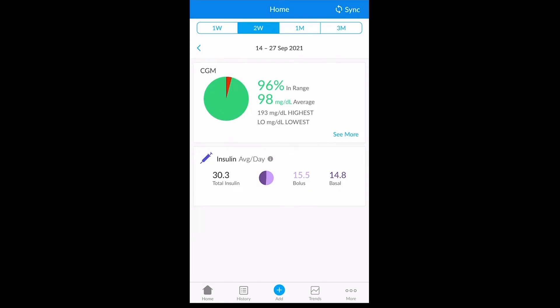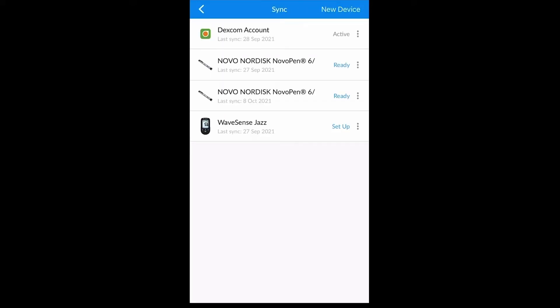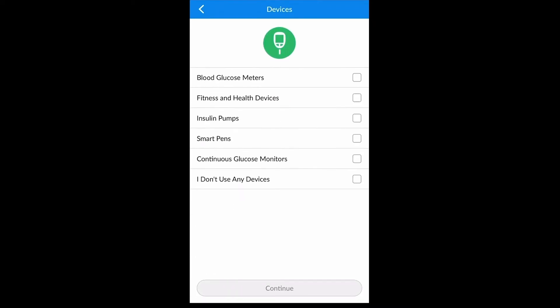In order to pair your device with the Gluco mobile app, first navigate to the sync option in the top right corner. Here you are able to select new device. Next you must select the type of device that you would like to upload — in this case, a blood glucose meter.